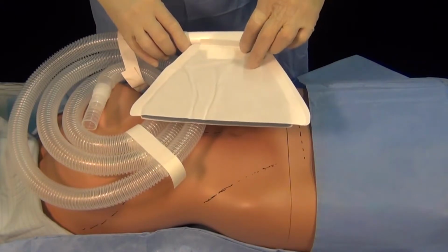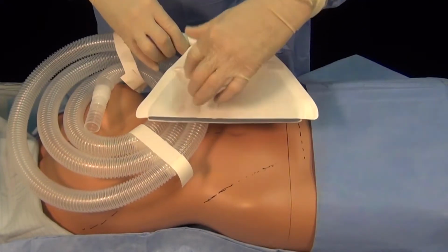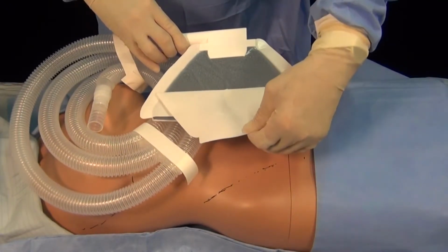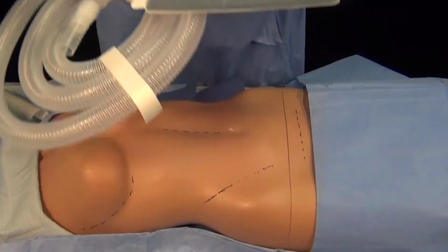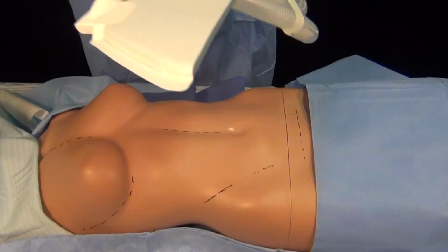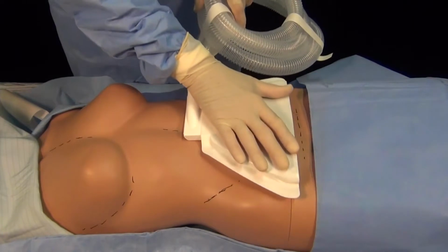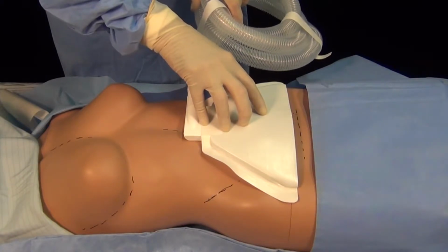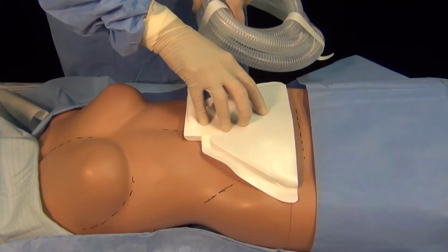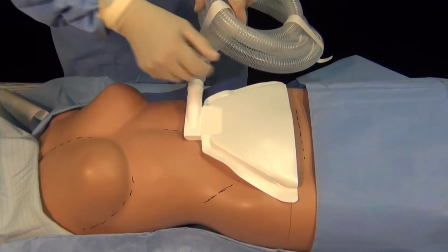Remove this white release paper from the device with the tab, and it's pulled straight down. You remove it. This is a very sticky surface, so it's meant to be used once and only once. We're going to start with the Pfannenstiel incision. It's placed as close to the line of incision as possible. You put it down, and that will be either on the dried skin, recently prepped, or if you have a surgical barrier drape, that, or the outer surgical drape last. But the point is, put the open cell foam as close to the line of incision as possible.